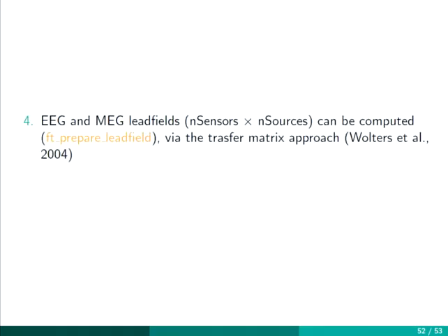And the final step is the EEG and MEG leadfield computation, where the transfer matrix approach will be used. This approach allows us to speed up the computation.